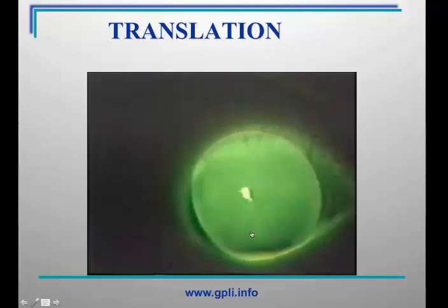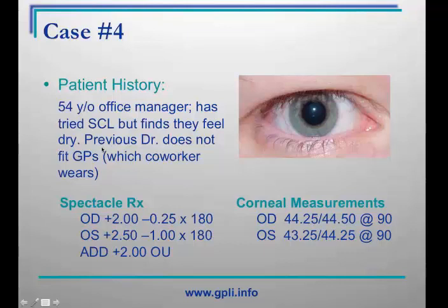So let's go to our final case. This is a 54-year-old office manager, has tried soft lenses but finds that they feel dry. The previous doctor this patient had does not fit gas permeables, but yet her co-worker wears gas permeable multifocals and is quite happy with them.